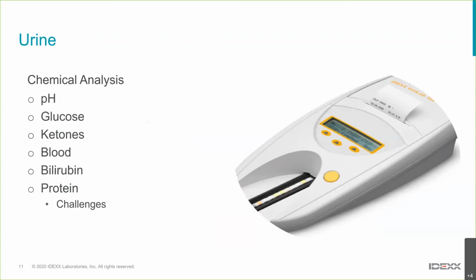We're going to look at bilirubin a little bit differently in cats and dogs. Dogs' kidneys have the ability to conjugate a little bit of bilirubin. So having some bilirubin in the urine in a dog is not necessarily an indication of underlying pathology. If you're getting a fair amount of bilirubin in very dilute urine, or really strong bilirubin in more concentrated urine, we need to pursue that further. But 1 or 2 plus bilirubin in urine with some degree of concentrating ability in a dog is not always going to be a concern.